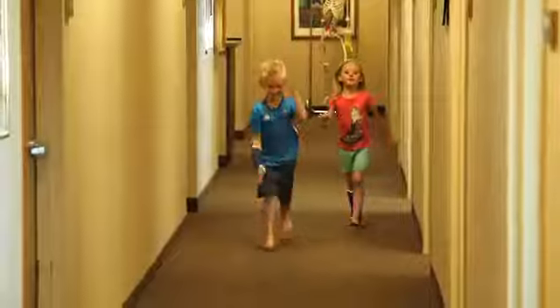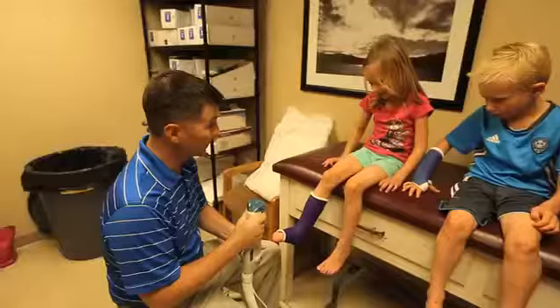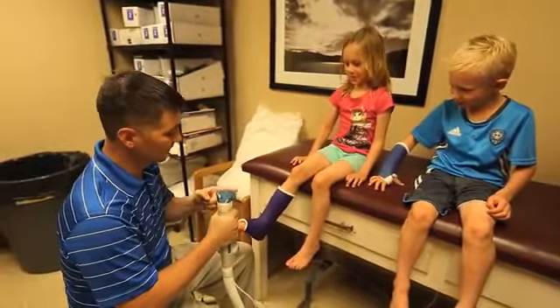After we finished getting it on, it dried as hard as a rock. And then the drill came and it drilled it off — it tickled so much that I laughed. It makes a lot of noise, kind of like your mom's vacuum.